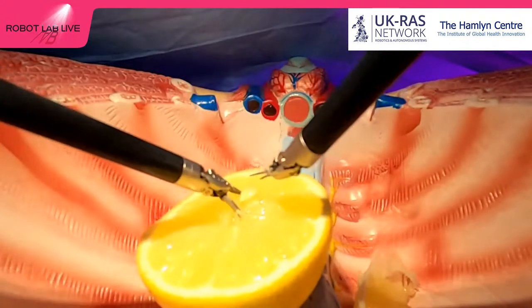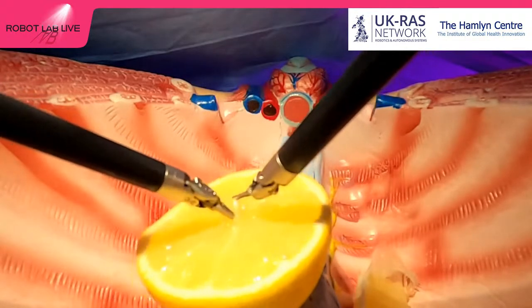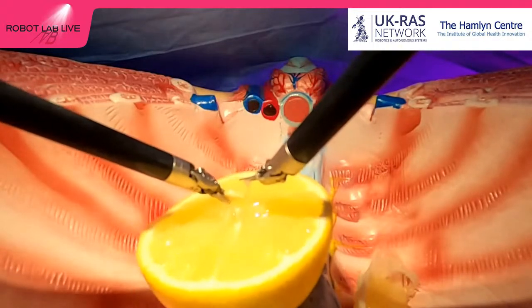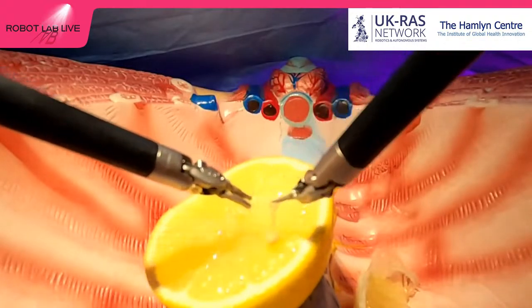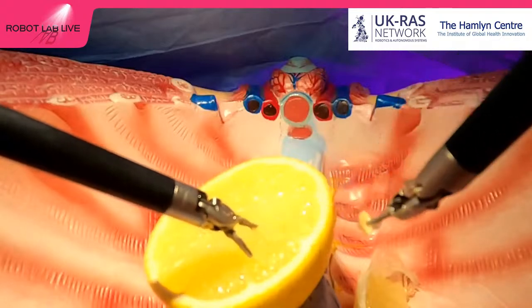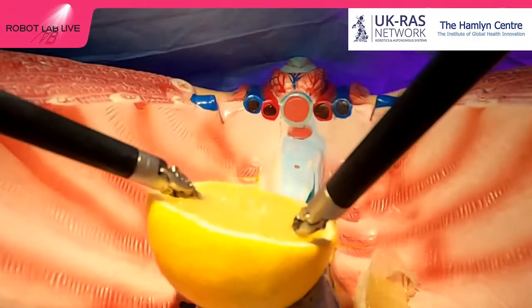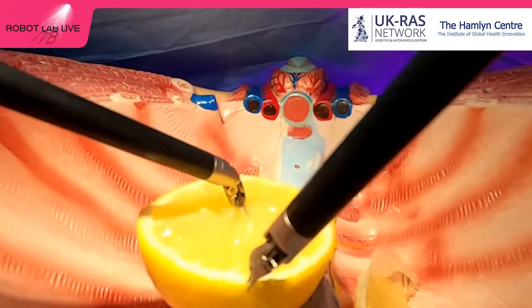And another example, and something really cool that Zen is working on, is new tools. And you can see it clearly, these tools are amazing. But if you think about them, they're quite stiff, right? So we go from the hands of the surgeon, which are soft, gentle, nice, compliant, to these tools, which are hard and stiff. So Zen is working on soft robotics, pneumatically actuated, that could help to do the surgery more gently and to cause less trauma to the patient.